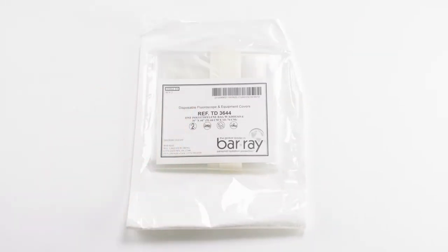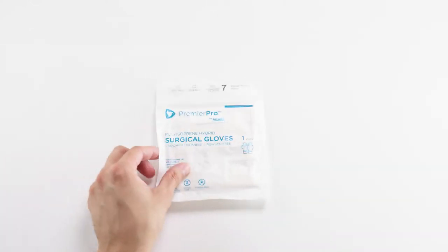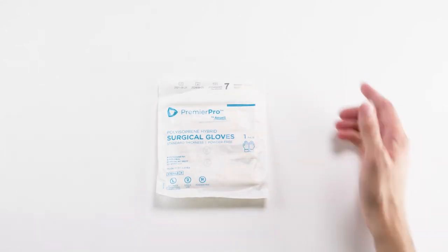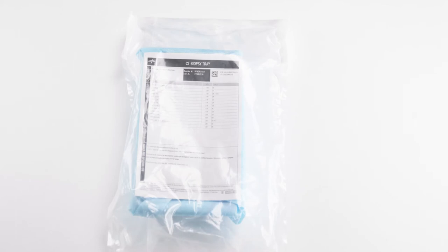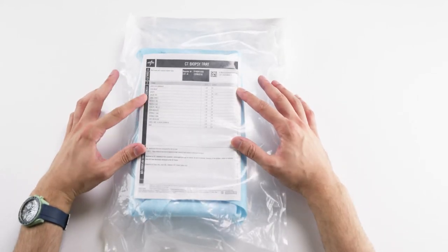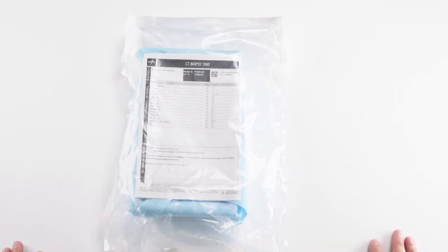In preparation for the insertion, we want to gather our materials and set up our sterile field, beginning with the adhesive tape that will be placed on the table. On our sterile field, we're going to place the following sterile equipment, beginning with size 7 gloves, which is my preferred size — I'd recommend wearing something comfortable for you. Alongside your gloves, you're going to use a sterile gown, also to be opened and placed on the sterile field. Next we'll use chloroprep, which we'll use to sterilize the skin. An ideal product that includes all of the material necessary, including your needles and syringes, is the link kit.